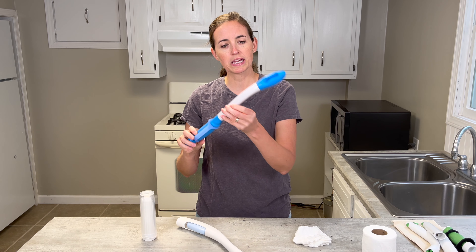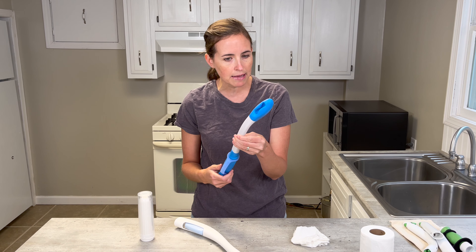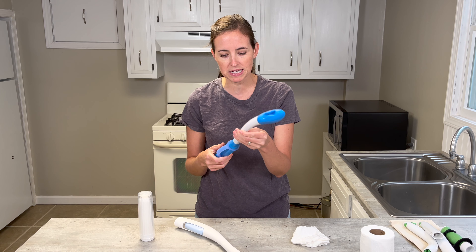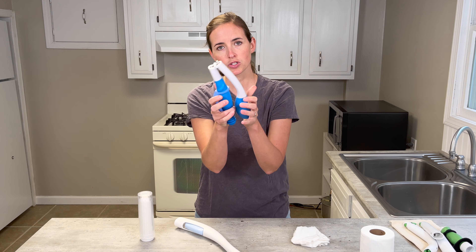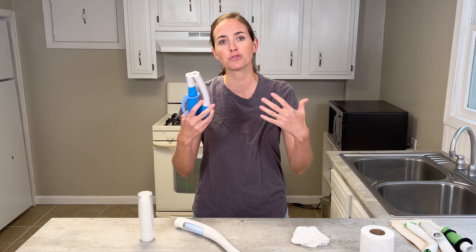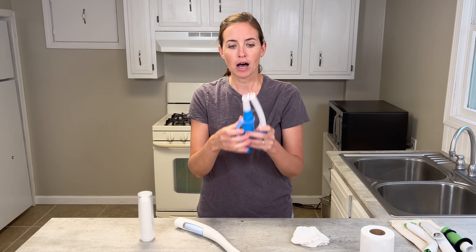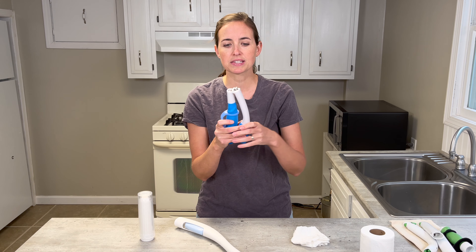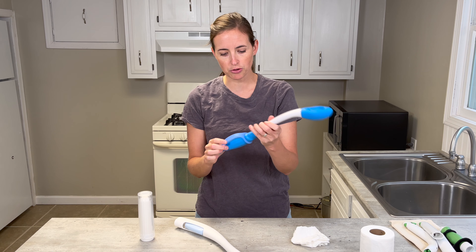The next one is a design that's got a lot of different names because it's been made by many different companies. This particular one I purchased because it's foldable — it actually folds in half, which is really nice for transporting it for use in public or at someone else's house. You could place it in a pouch and bring it with you.